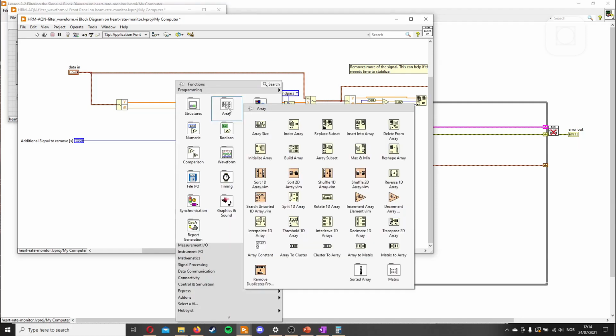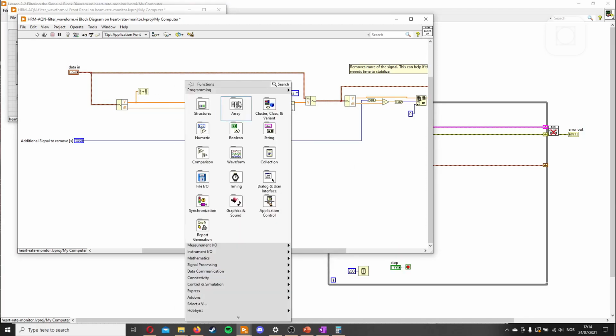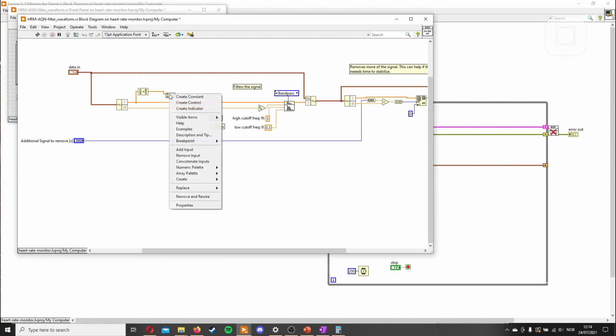Into the array here, and we have one that rotates the array, but that's not the one we want. Reverse the array. Here you go. So we reverse the array, and then we get another array, build array one. And we'll take the reversed one in here, and remember to put it on concatenate because we still want the 1D array. And we combine these, and then we put this one into the filter instead.